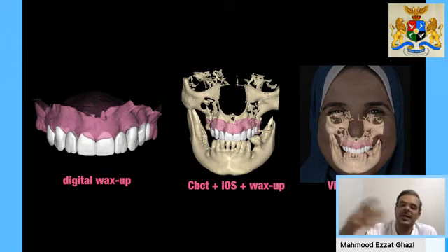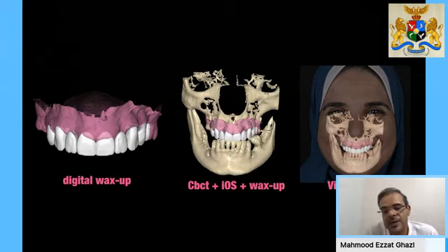But at the end, the prosthetics will either turn out to look very bad, or it would be impossible to restore for the patient, or you would have detrimental, of course, functional loads on these prostheses, which could cause failure for your implants later on. So we started to understand that we need to have a prosthetic-driven or restorative-driven treatment plan, where we need to plan where our tooth is going to be first according to function. Mostly at that time it was according to function. And then accordingly, we would have a virtual crown there, or a manual wax-up that was done. And then we would plan where the implant would be in the most suitable position to the prosthesis.